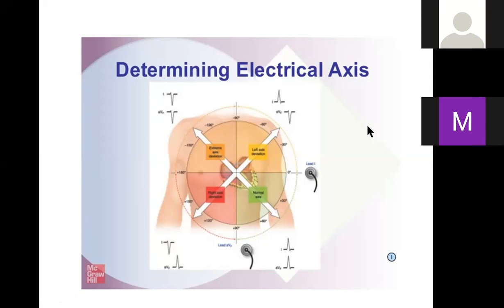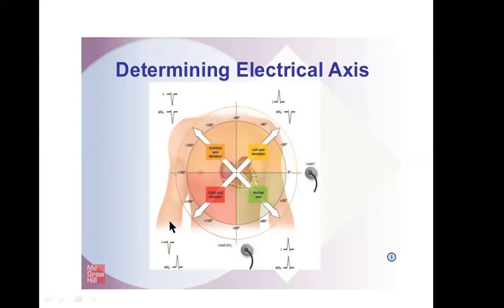And when the thumb in lead 1 is downwards and upward in the AVF, they reach each other. Right reaches its destination. You walk on the right path and you reach your goal. This is right axis deviation.